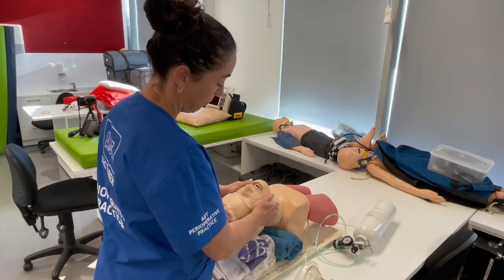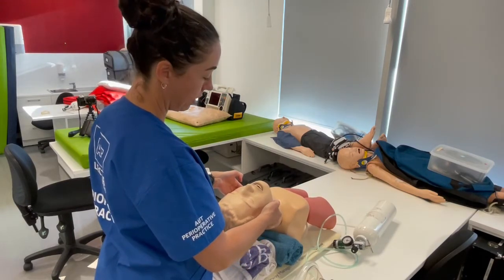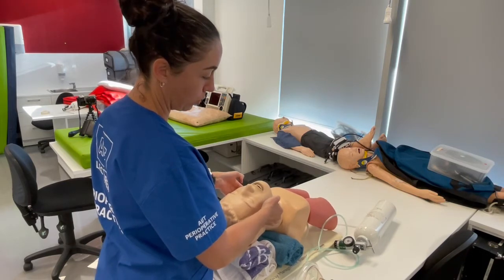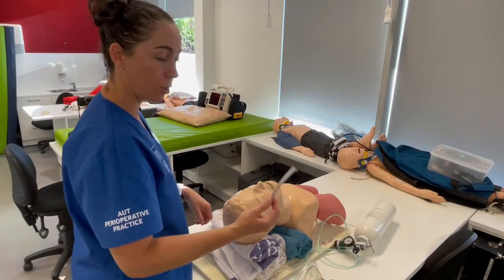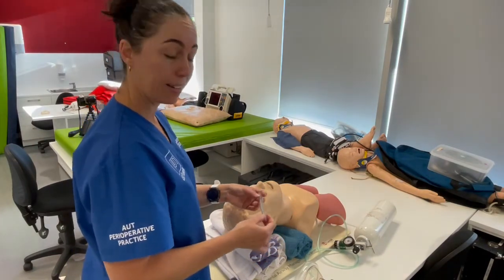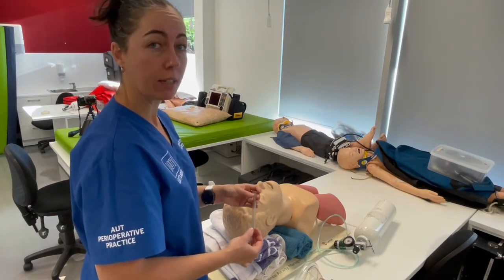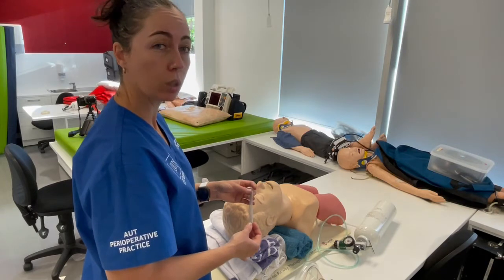You can perform the jaw thrust so that if the head is heavy enough it counteracts the force needed to hold the bottom jaw up. Your nasal airway is sized by the patient's height regardless of gender — an average height patient takes a size 6 nasopharyngeal airway, and a taller patient takes a size 7.